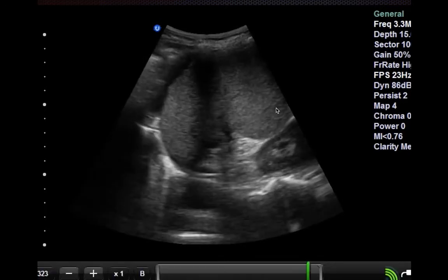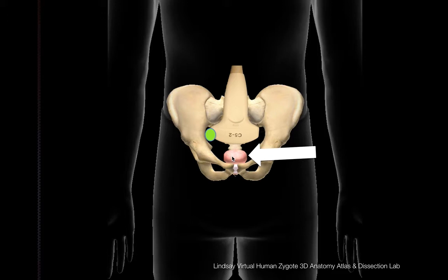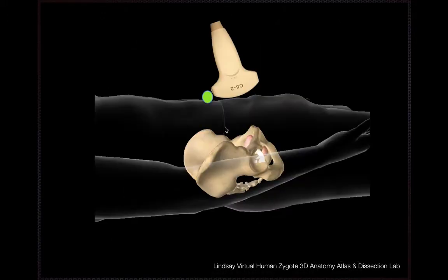For the pelvic view, place your transducer with the probe marker towards the patient's right, just above the pubic symphysis, angling down a little towards the feet because the bladder is behind the pubic bones. Once you obtain a transverse view, sweep through the entire bladder from front to back. Then obtain a longitudinal view of the bladder with the transducer marker towards the patient's head. The longitudinal view is more sensitive for picking up smaller amounts of fluid than the transverse view, so it's important to do both.